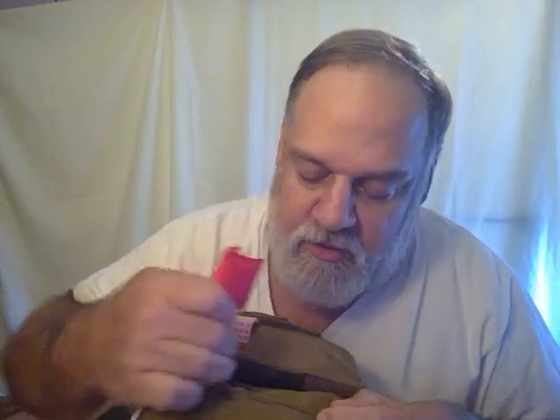Like I said, I got 3 tourniquets on the outside of mine. I can take care of somebody with a gunshot or a bone poking through their leg and a gunshot or 2 bones or whatever. Well, you got to stop that damn bleeding. I got 3. Especially this one. I keep in the bag. That's my personal, no matter what. Keep it clean. These are the 2 quick grabs.